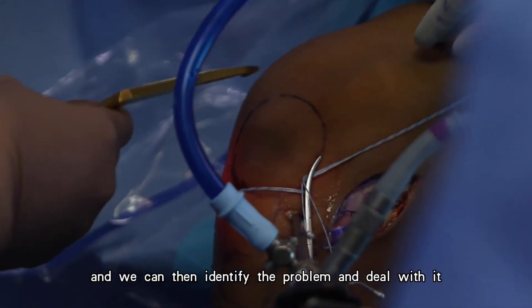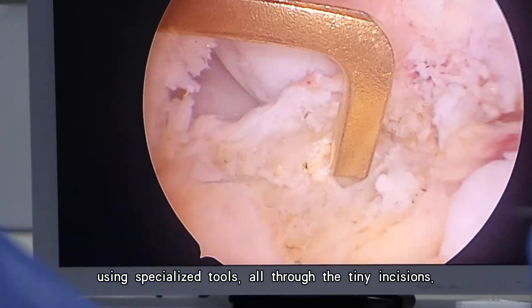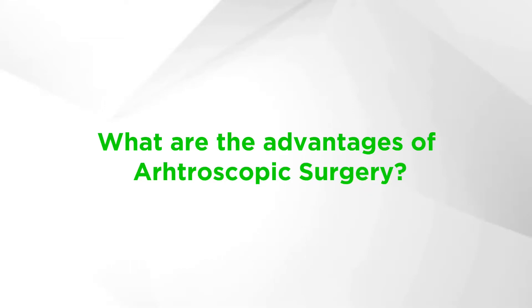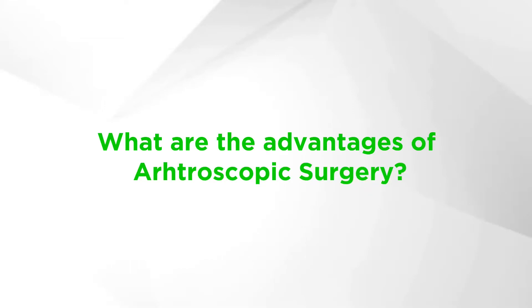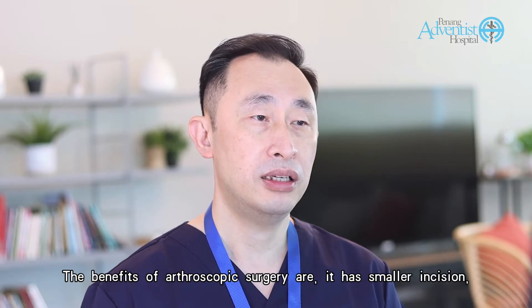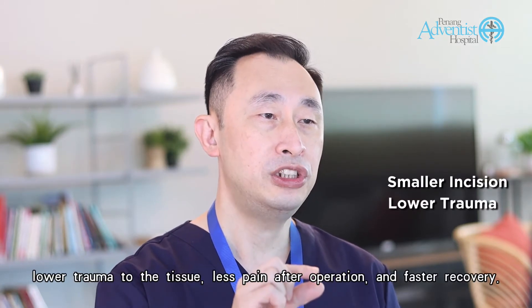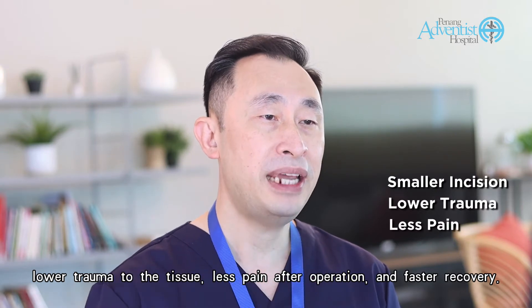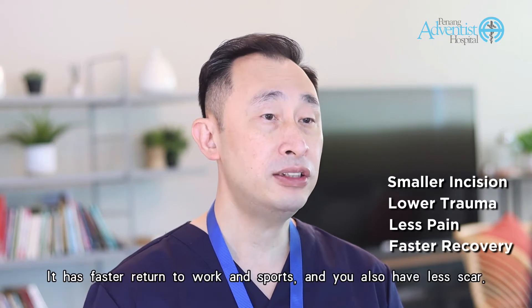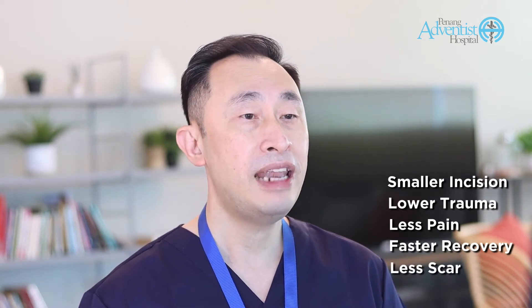We can then identify the problem and deal with it using specialised tools, all through the tiny incision. The benefits of arthroscopic surgery include smaller incisions, lower trauma to the tissue, less pain after the operation, faster recovery, faster return to work and sports, and also less scarring.